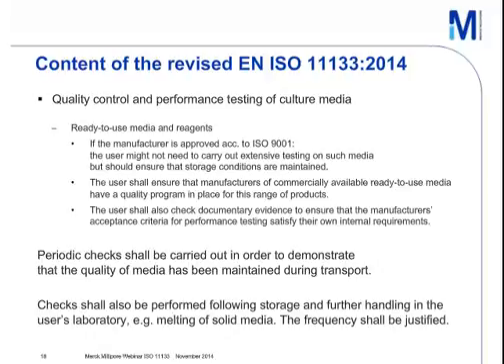The user shall ensure that manufacturers of commercially available ready-to-use media have a quality program in place for this range of product for the culture media. The user shall also check the documentary evidence to ensure that the manufacturer's acceptance criteria for performance testing satisfy their own internal requirements, for example, following EN ISO 11133 from 2014.